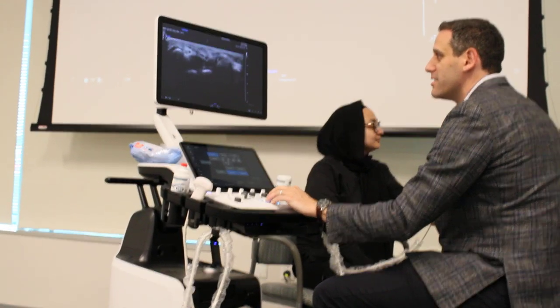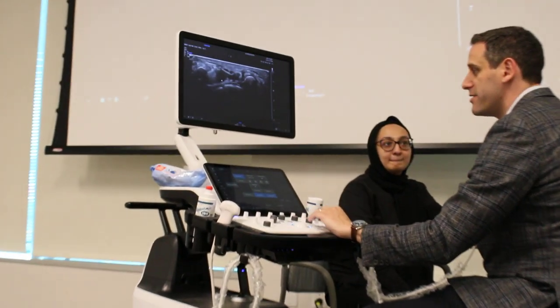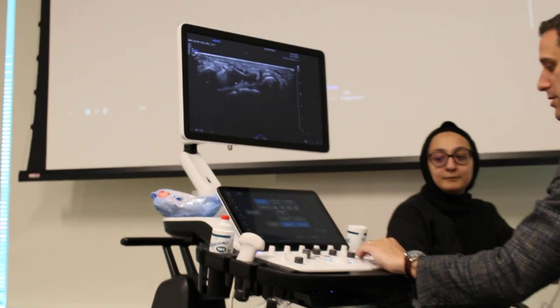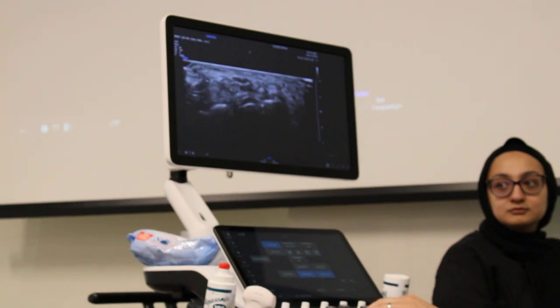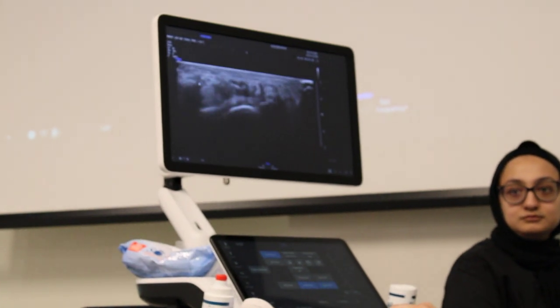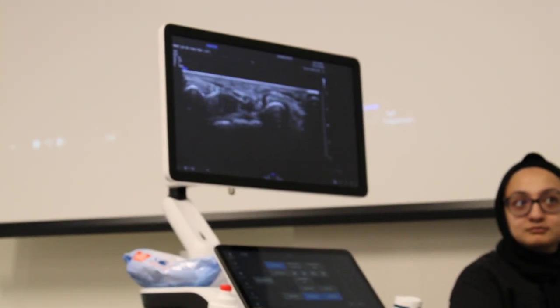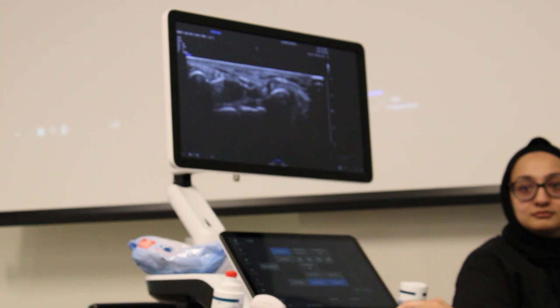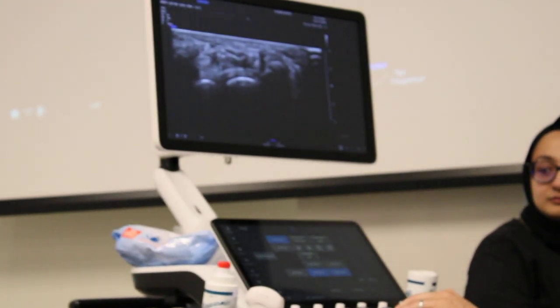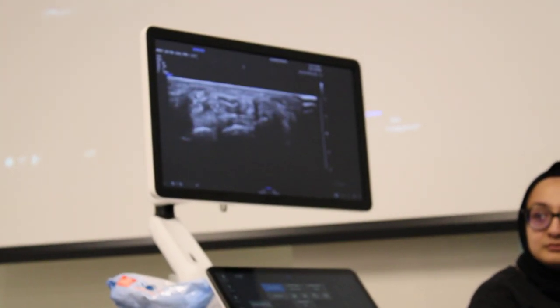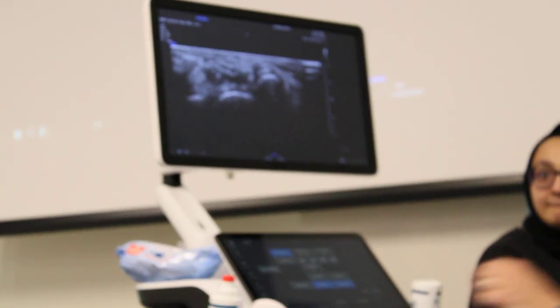So what you guys can see here is you can see how well we can see the soft tissue structures. And I'll go through the structures in a little bit.